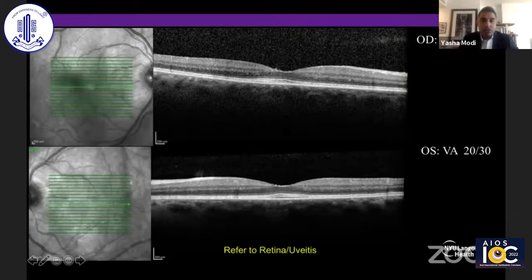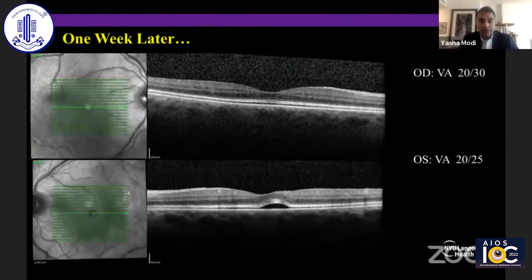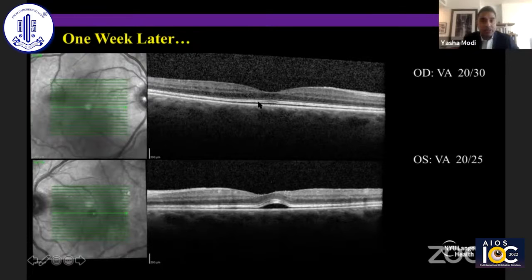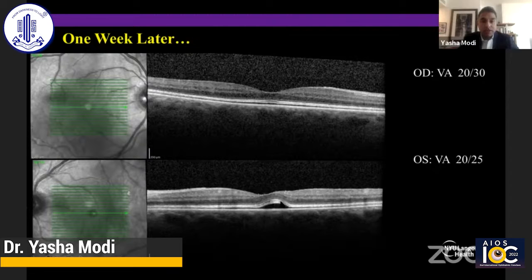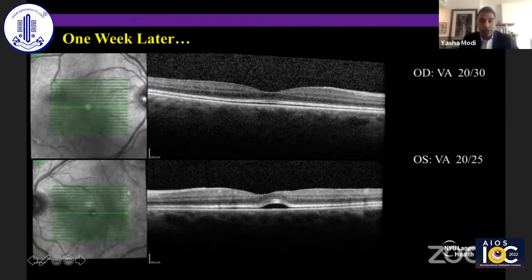Because of the vitreitis, she was referred to me and I saw this patient one week later. Now we see something relatively subtle, but the difference to retina specialists may be much more obvious. She has this hyperreflective space uniformly between the interdigitation zone and the RPE in the right eye. In the left eye, there is what looks like a bleb of subretinal fluid and this sort of uniform splitting of the interdigitation zone and the RPE.